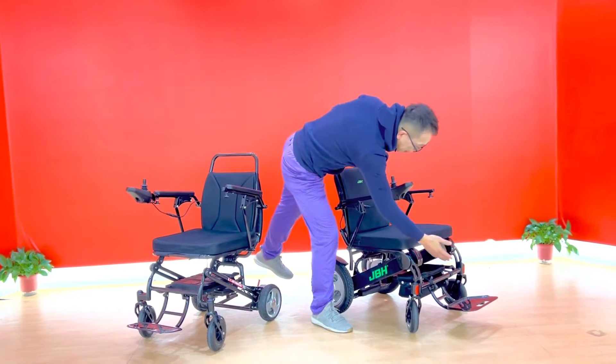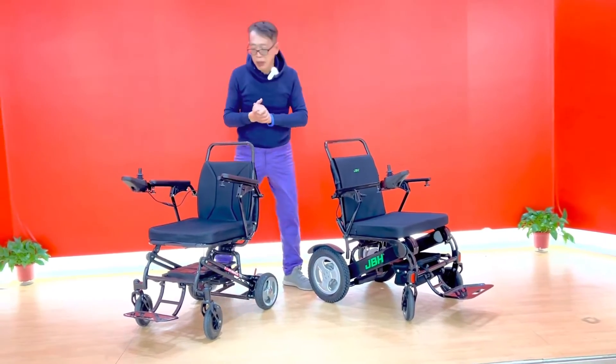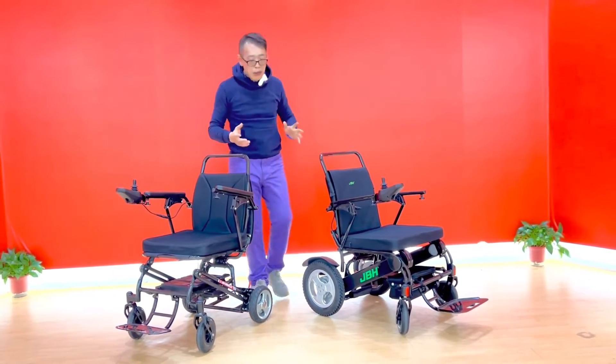This one has a very convenient storage bag space in the back — there's space here for an additional storage bag design. This one, with the battery placement here, we don't have any storage bag for you.